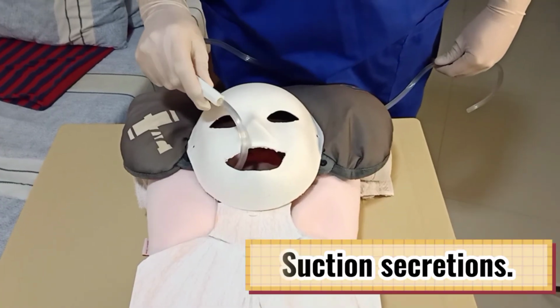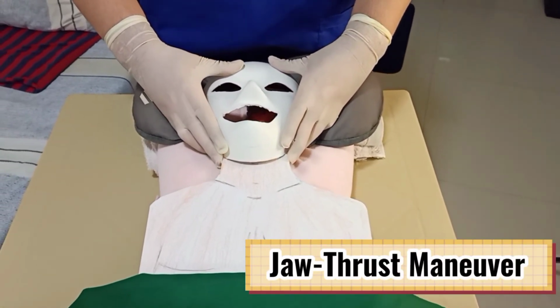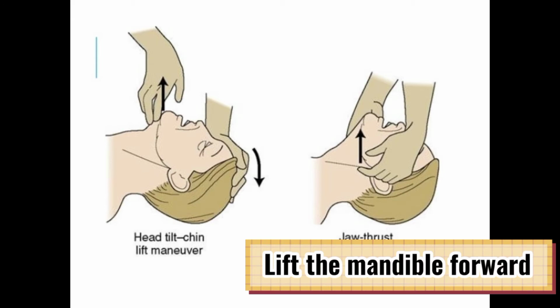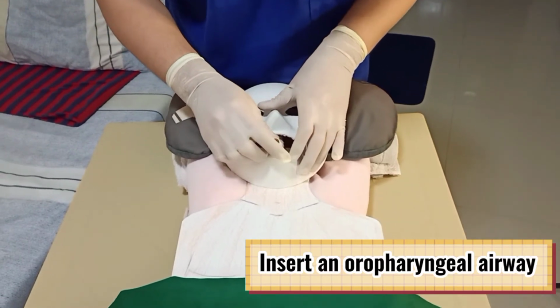Now, suction any pooled secretions. Then, a jaw thrust maneuver can relieve the occlusion in the upper airway in unconscious patients and re-establish airway patency and flow. This is done by lifting the mandible forward and preventing the tongue from obstructing the trachea. Then, insert an oropharyngeal airway to temporarily facilitate adequate ventilation.